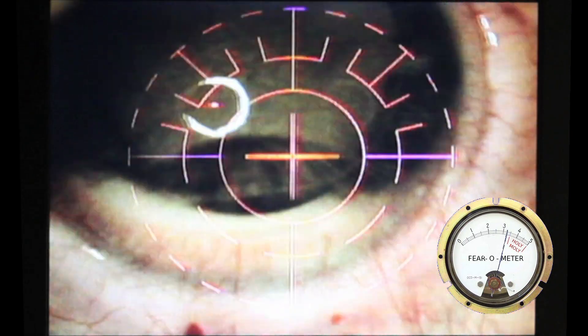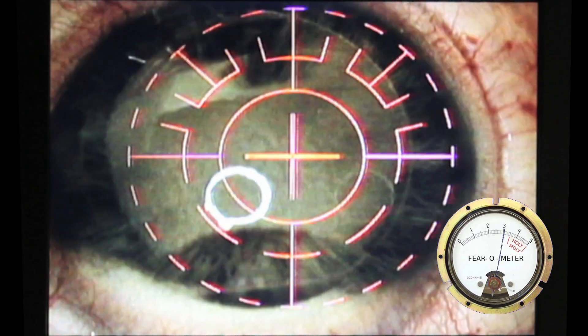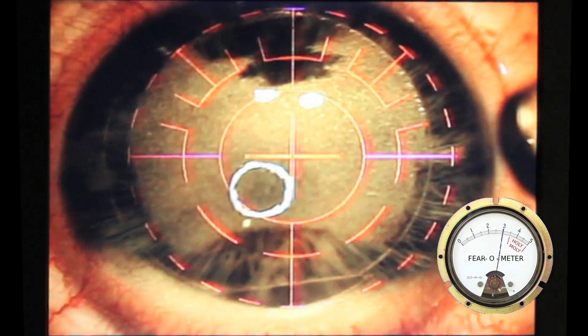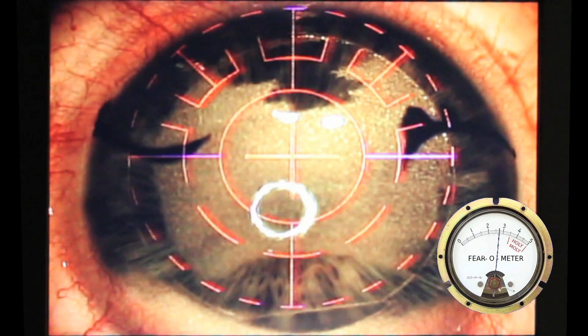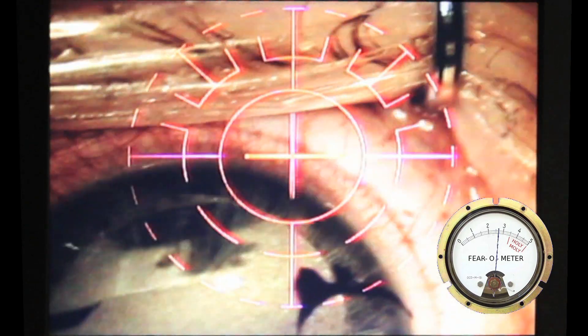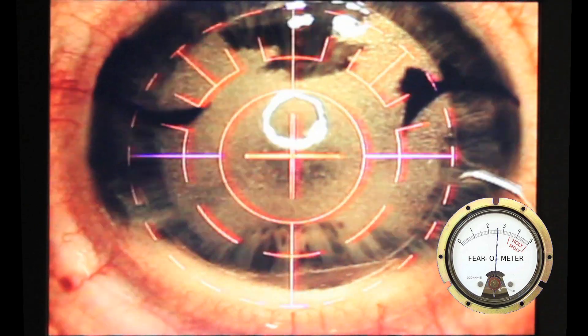Well, then they clamp your eye open and then they mark the flap. At least I'm assuming that's what he does with this little dye thing. He marks the flap on each side. And my assumption, being a carpenter and an engineer, is that this is just in case he accidentally tears the flap off. He knows how to put it back on. I don't know if that's true or not. I'm a layman. But it seems like that would make sense to me.